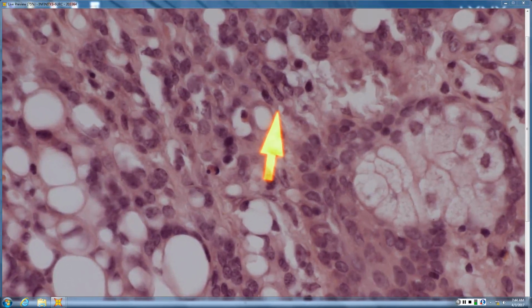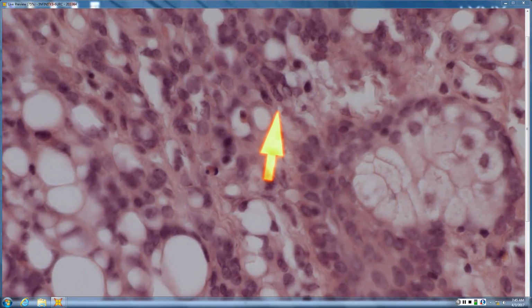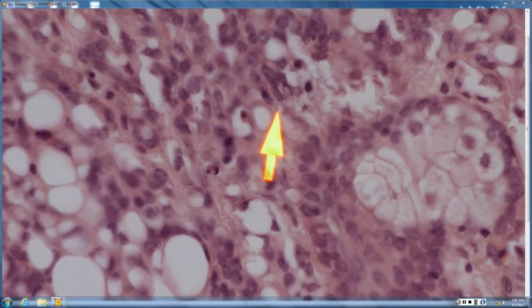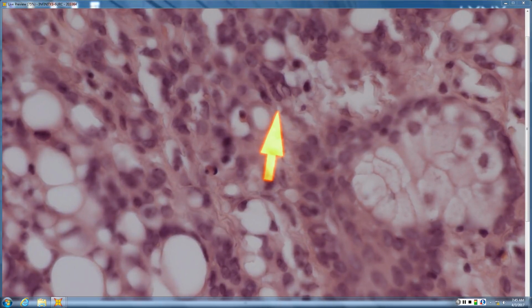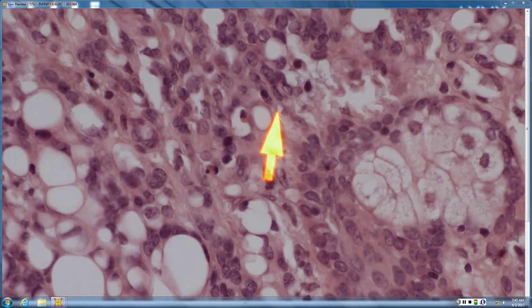What's that characteristic of? It's the epithelioid hemangioendothelioma. And we just talked about spindle cell hemangioendothelioma being completely benign. How about these? It's like low-grade sarcoma. Like low-grade sarcoma, correct. So epithelioid hemangioendothelioma, a nodular and diffuse proliferation of endothelial cells characterized by these round intracytoplasmic vacuoles, behaves like a low-grade sarcoma. Absolutely correct. Very good.